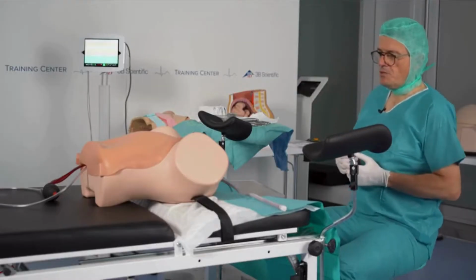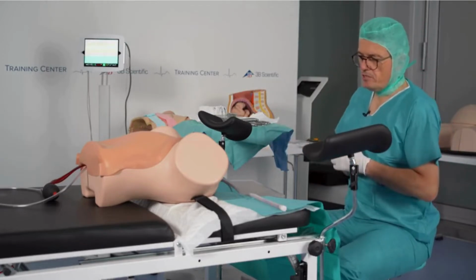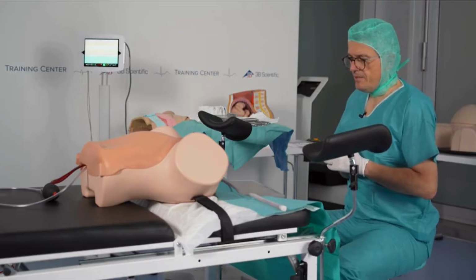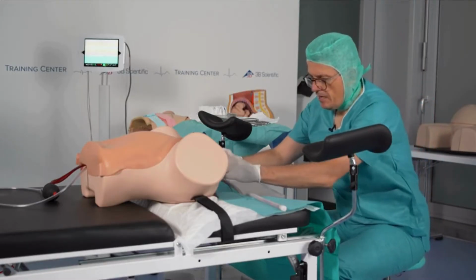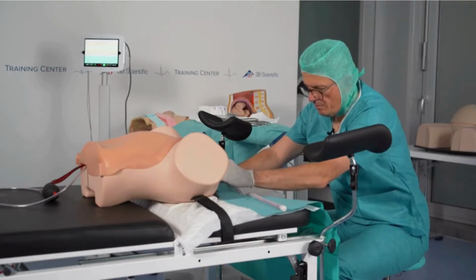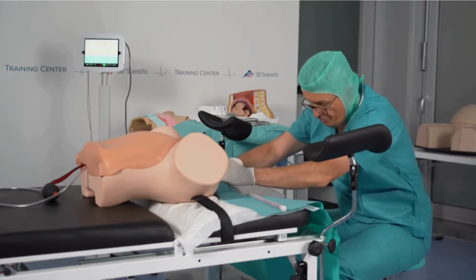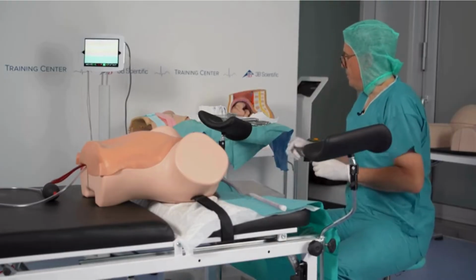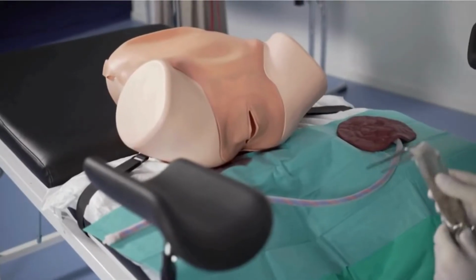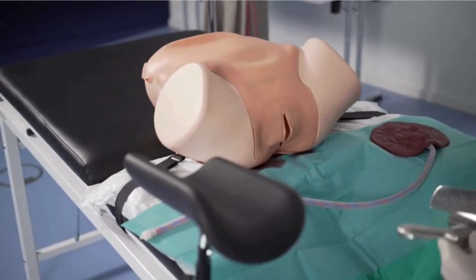So what we can now see here is that the patient is already bleeding rather severely, and that it's obviously coming from the uterus. I spread the vulva a little bit and I can see the blood coming from the uterus most probably. And the first thing we do is we try to do a curettage.